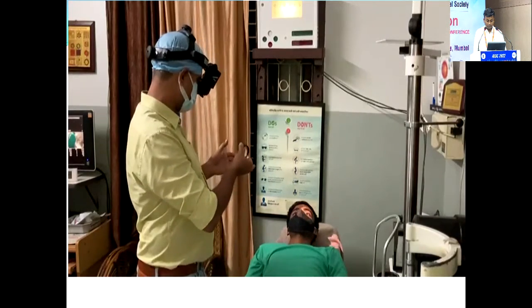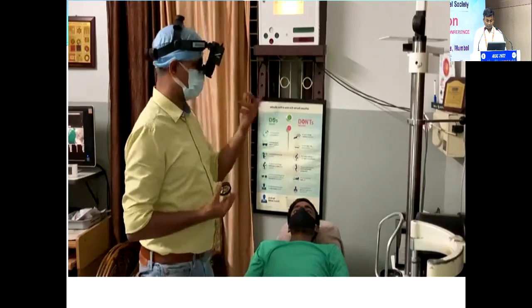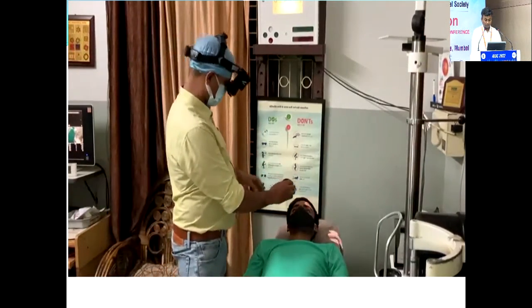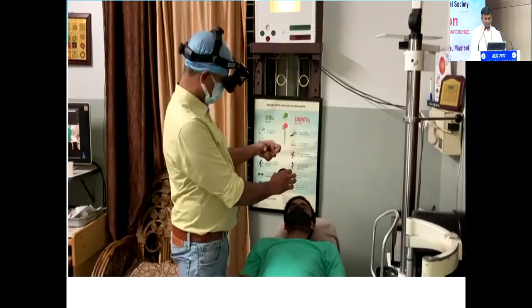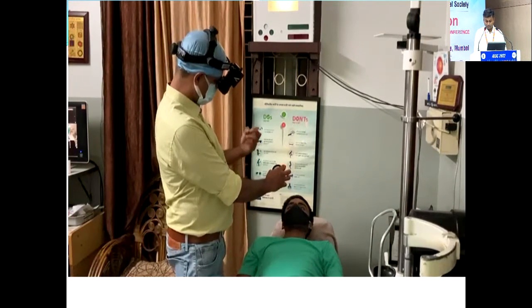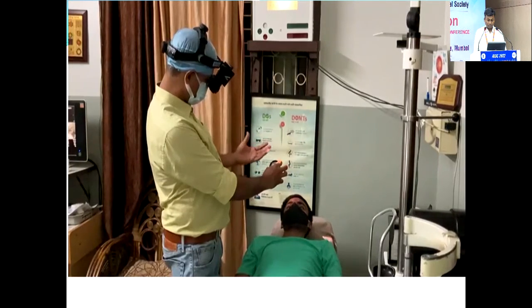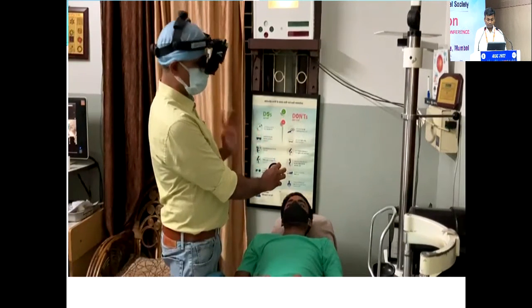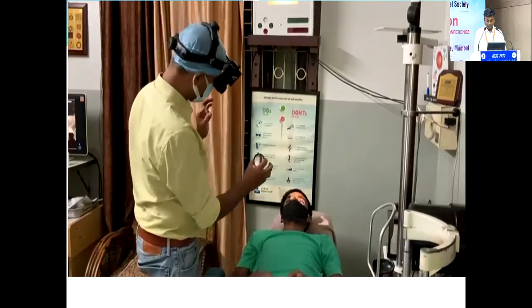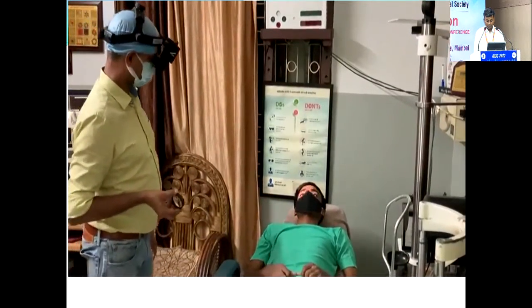So the whole concept is they will lie parallel and meet only at the fundus, so that we can see the image. And then while we place the convex lens, this image which is coming from the fundus gets focused somewhere near the principal focus of the condensing lens, which is between the observer's eye and the condensing lens. So this is the basic principle of the indirect ophthalmoscope.